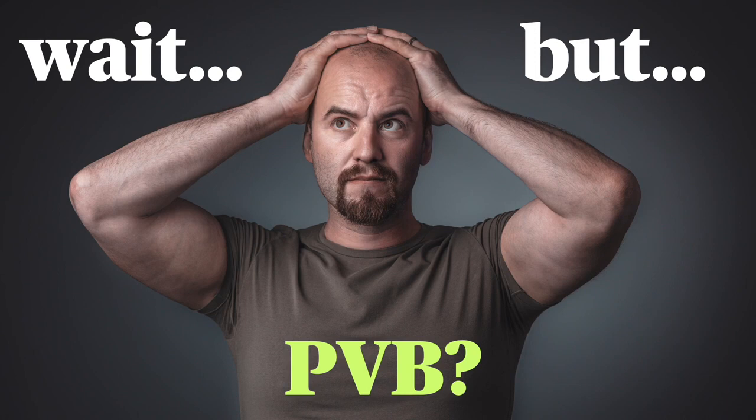Some of you may be thinking, wait, I thought you loved paravertebral blocks, and I do, but lots of people aren't excited about the deep imaging at the paravertebral space and prefer a shallower approach where the visualization is easier. Intercostal is also a block that's widely used around the world by many specialties: emergency medicine, trauma surgery, thoracic surgery, and chronic pain specialists, so it does have a big role.